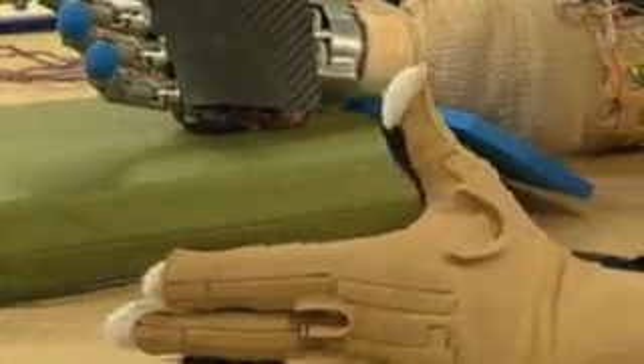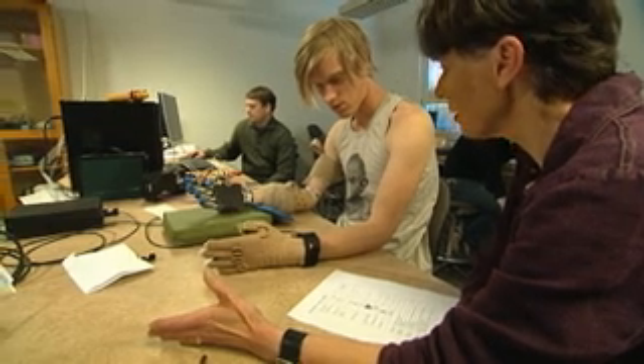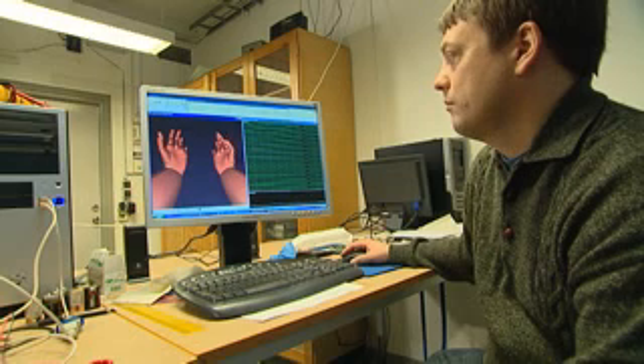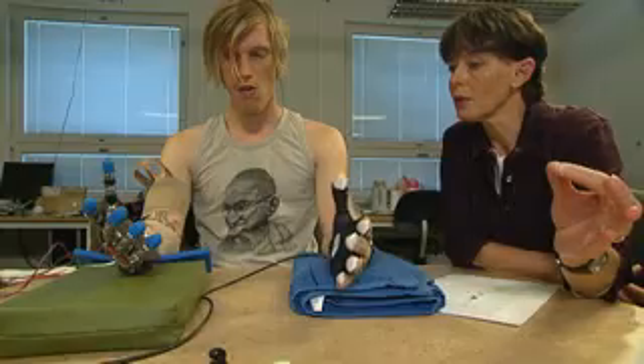Scientists of the European research project SmartHand have created one of the most sophisticated artificial hands in the world. During a workshop in Lund, Sweden, they fitted a robotic hand on a prosthesis which includes four motors and forty sensors.